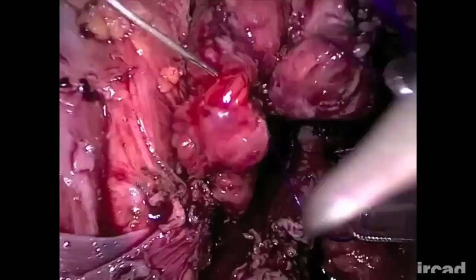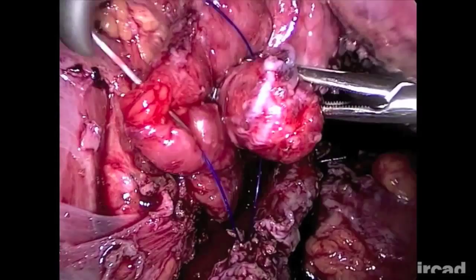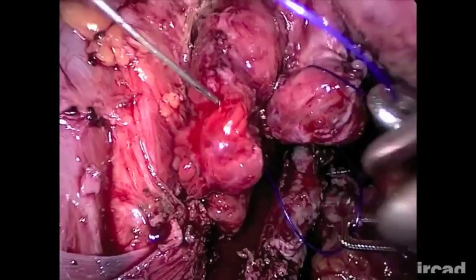In addition, crossing the abdominal wall can be particularly challenging in obese patients. Finally, even in expert hands, results can be different from those expected.